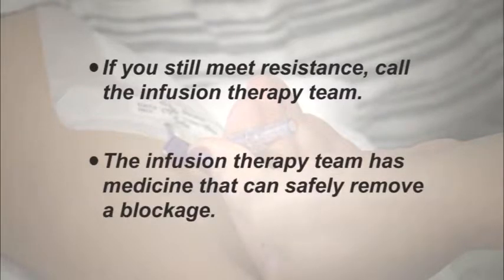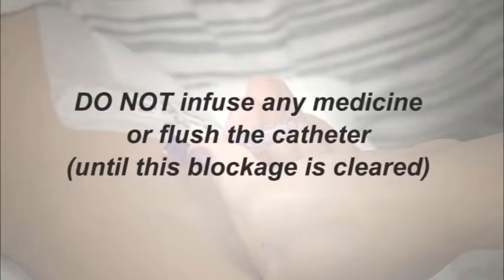The infusion therapy team has medicine that can safely remove a blockage the next time you return to the infusion therapy clinic. While this is not an emergency, it is important that you do not infuse any medicine or flush the catheter until this blockage is cleared.